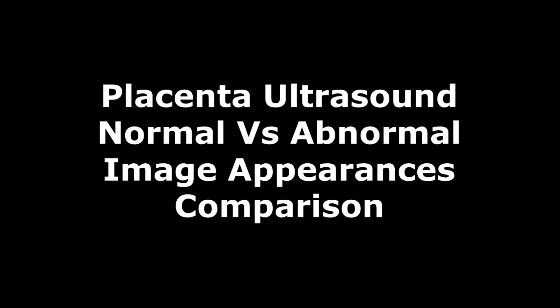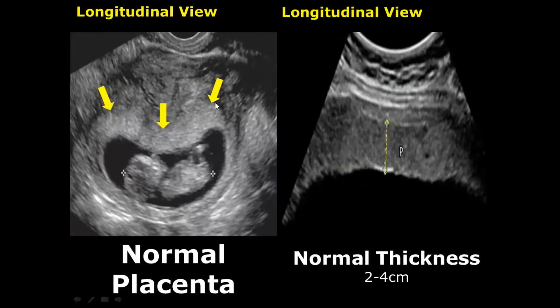Hello everyone, this is Dr. Sam and today we will discuss the ultrasound appearances of the placenta. The placenta is an organ that supplies blood to the fetus; it starts forming around 11 weeks of gestational age and is well visualized by the end of the first trimester, that is 13 weeks, appearing as an echogenic structure. The normal thickness is between two to four centimeters.